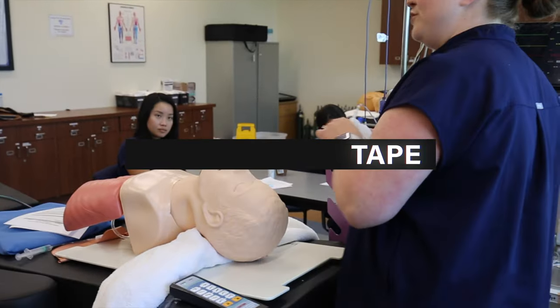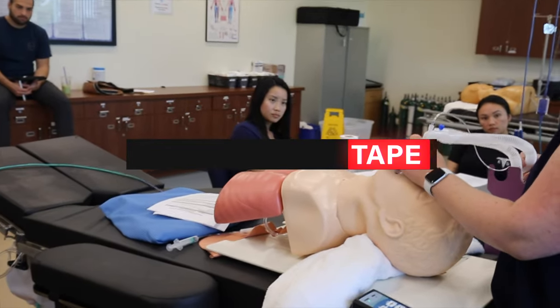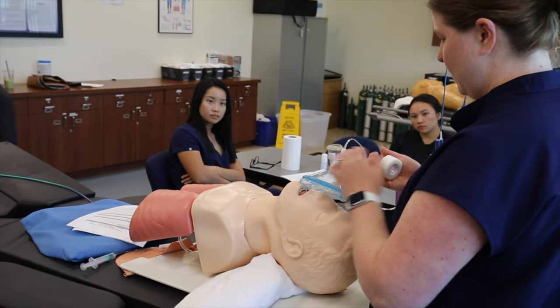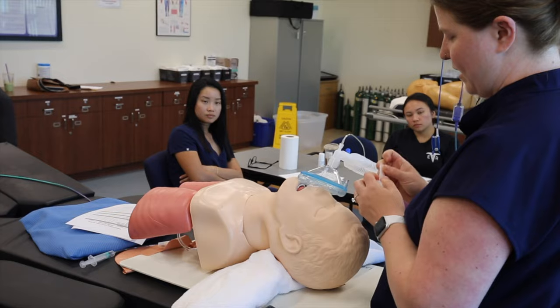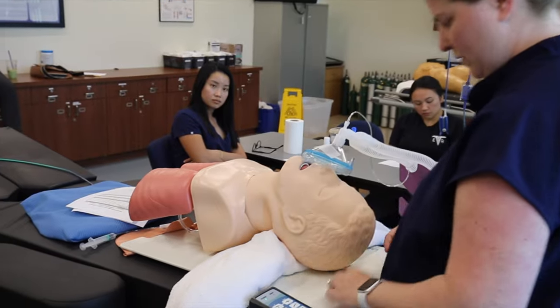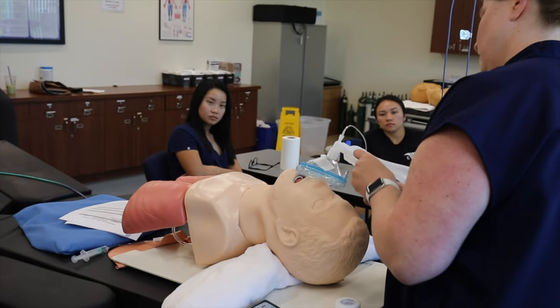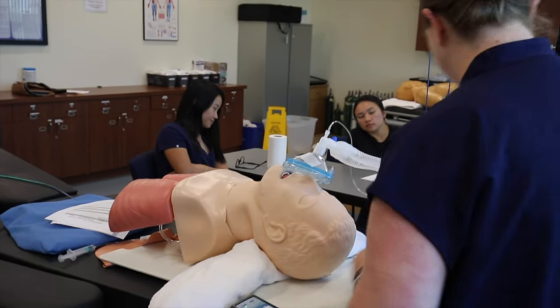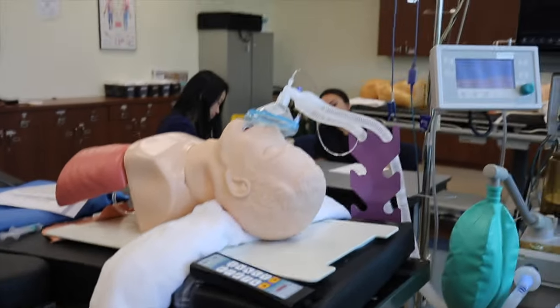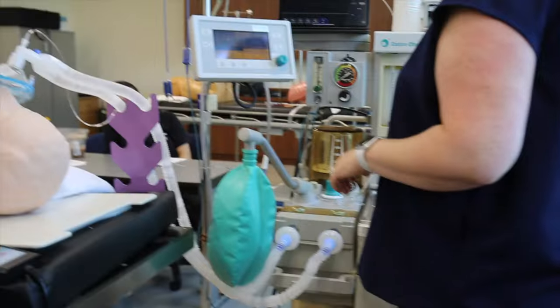T is for tape. Do not put tape on the machine for me. It's gross and leaves sticky residue everywhere. Not cool. So what I like to do is put tape for the eyes on the mask. You set yourself up. It's right there. It's a little reminder. Tape the eyes. Just like that. So you have tape for the eyes, and then you have tape for your ET tube. Good habit to leave the tape with a little folded tab on the end, so you can pull it off easier. So T, tape.